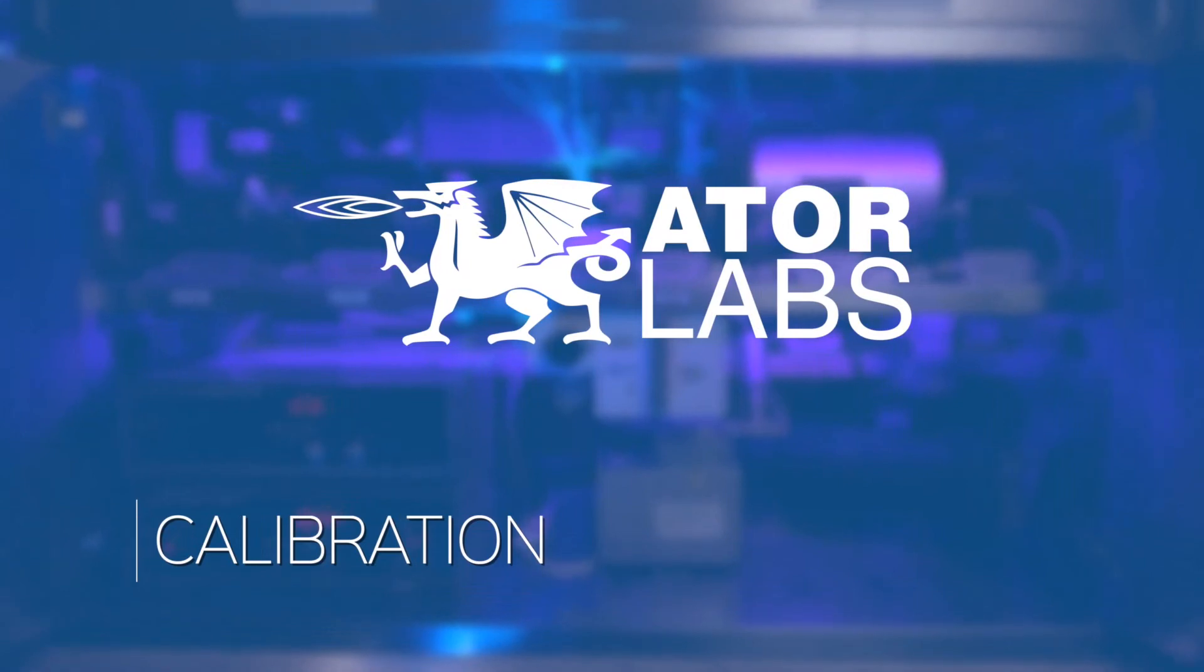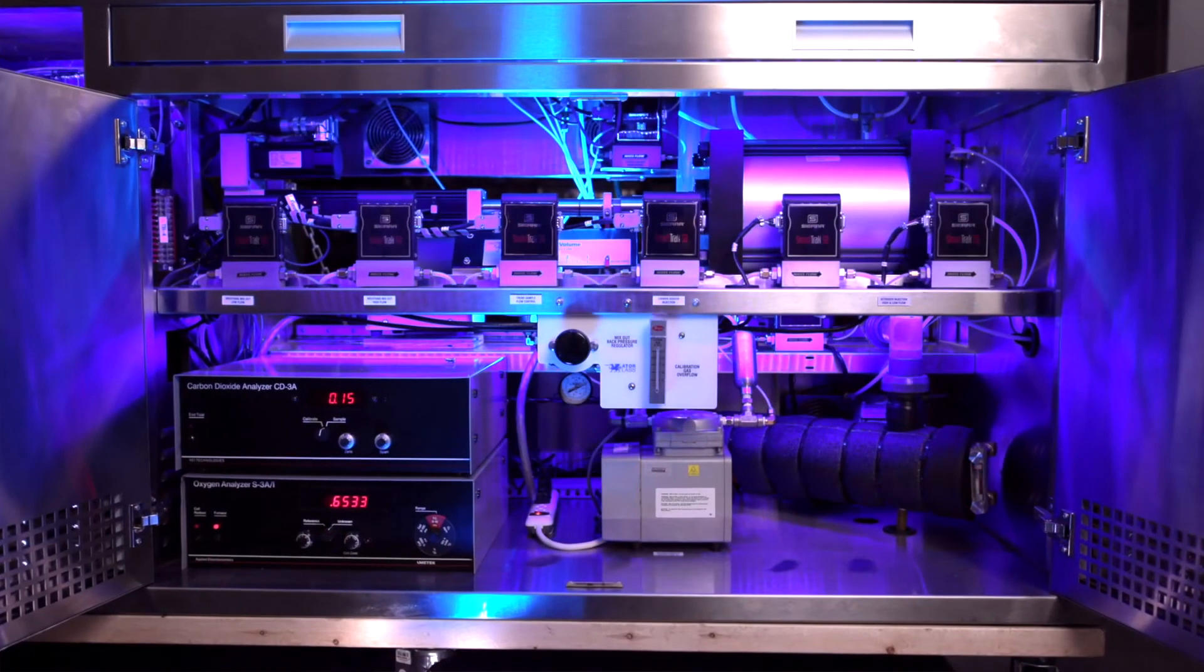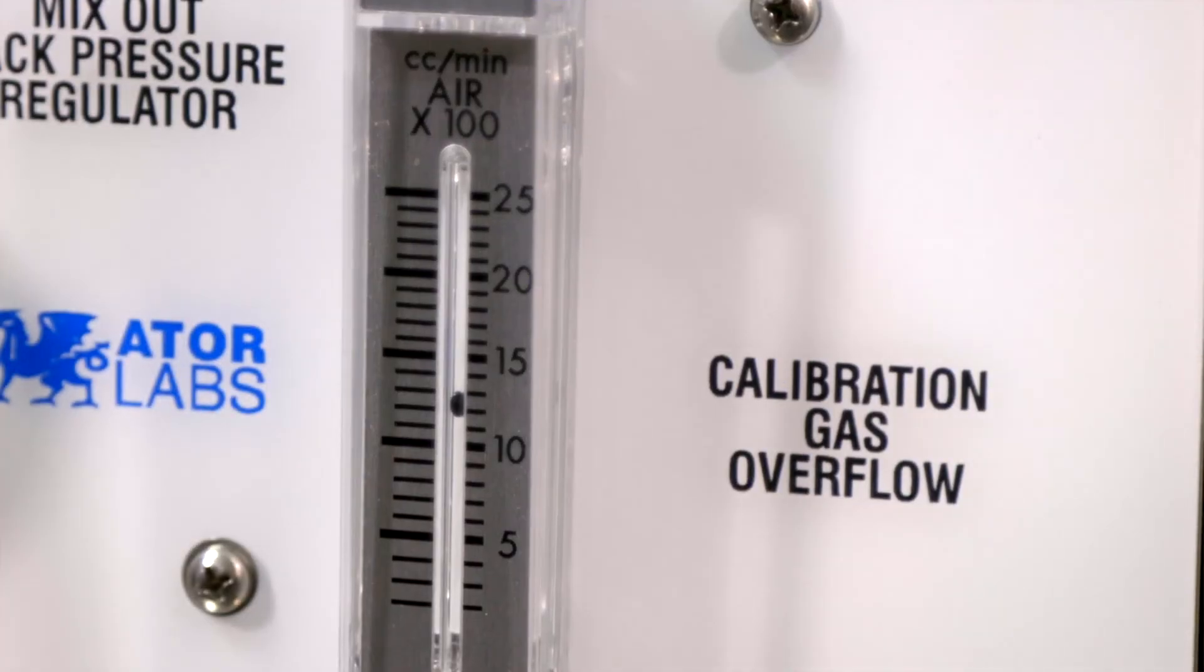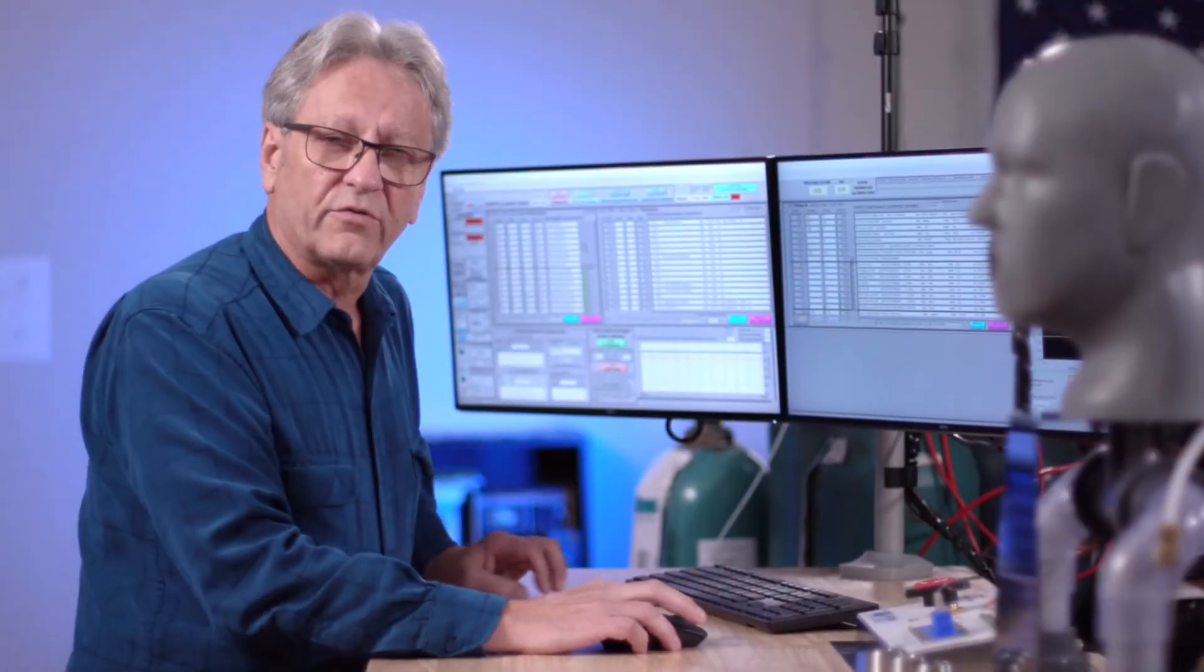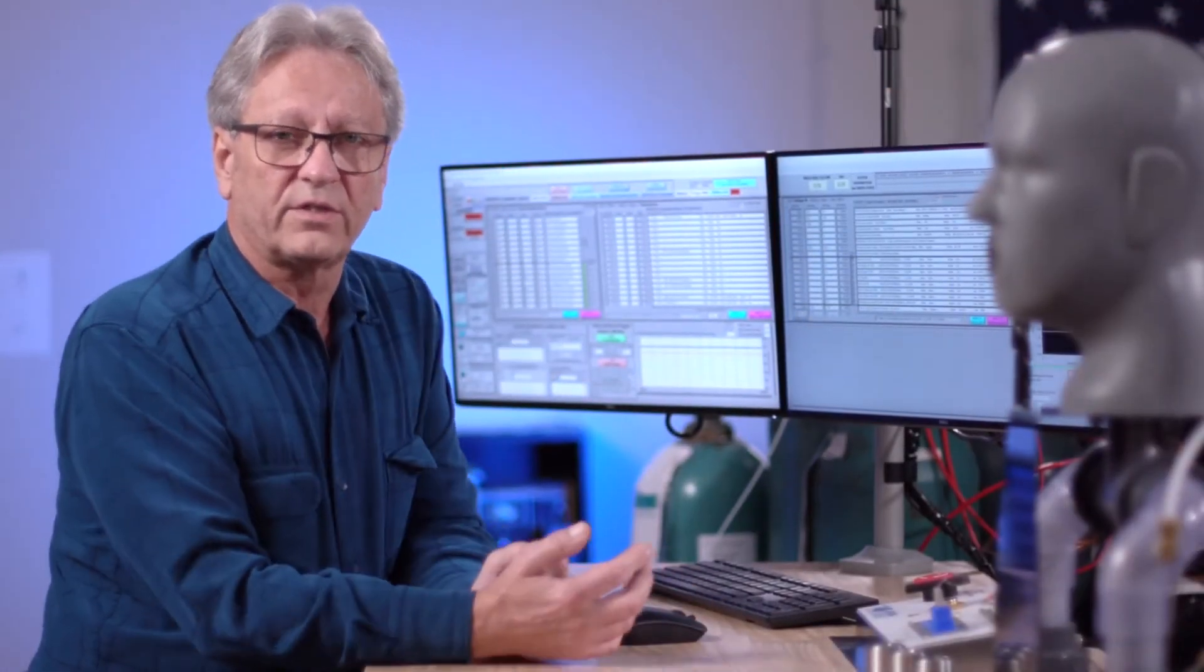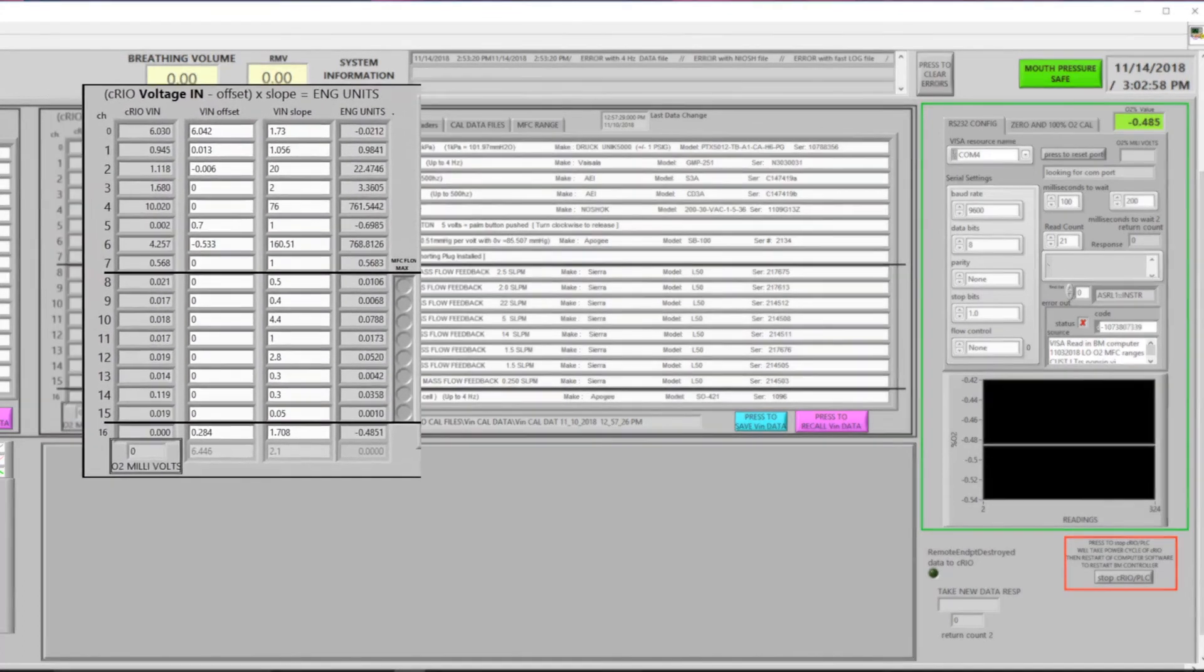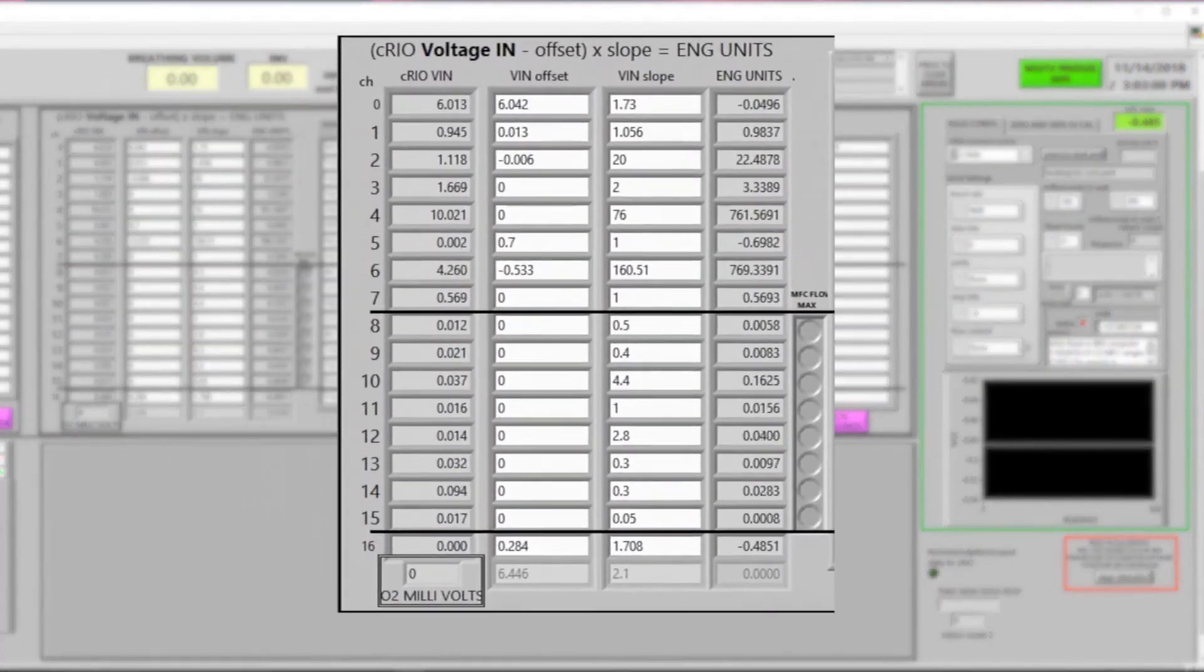In this video segment we're going to look at the calibration of the equipment attached to the ABMS. The entire calibration process can be completed in about five minutes or less. The single button on the screen will allow us to calibrate both the 500 hertz CO2 and oxygen analyzers as well as the trending oxygen and CO2 analyzer. The slope and intercept values for all of the equipment on board is given here in the calibration screen.